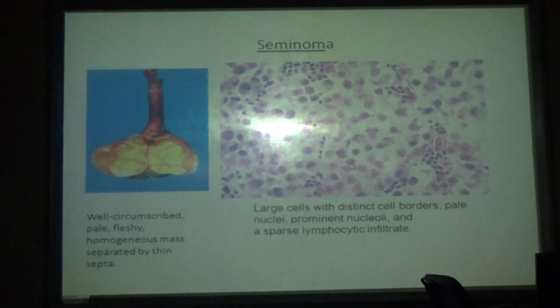This is the nucleus, this is the cytoplasm. Further here, this is the nucleus. Inside, what you are seeing is a pointed nucleoli, and this is the border. Here also you can identify the nucleoli and the nucleus.